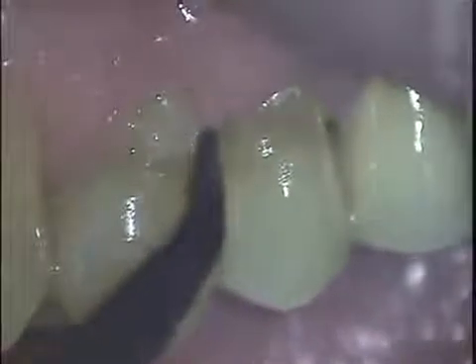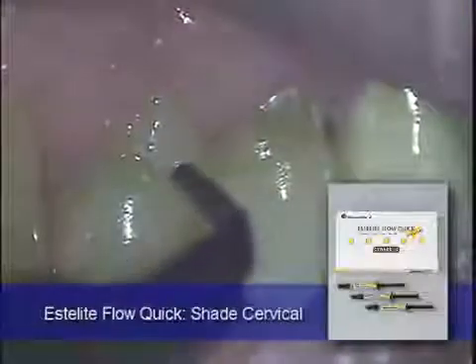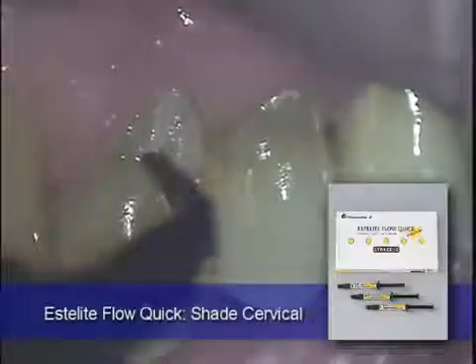Here, the Estelite Flow Quick is placed in 2mm increments, cured for 10 seconds, and built up in layers until completion of the cavity preparation.